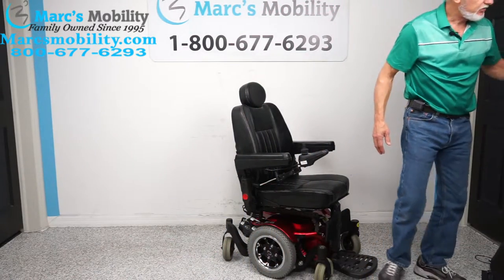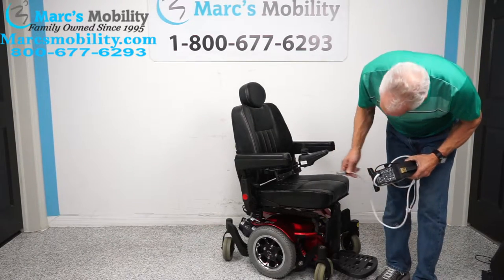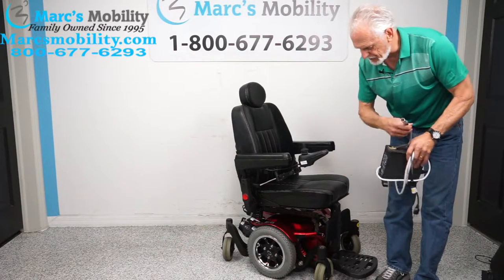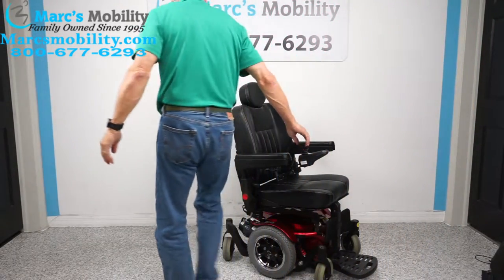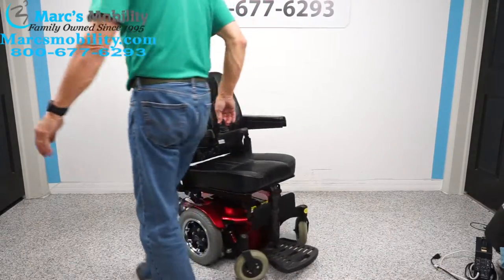When you charge the batteries in this chair, take your charger and plug it right here. As soon as it goes from orange to green, the charger will stop charging. Let me show you the turning radius on this chair one more time.